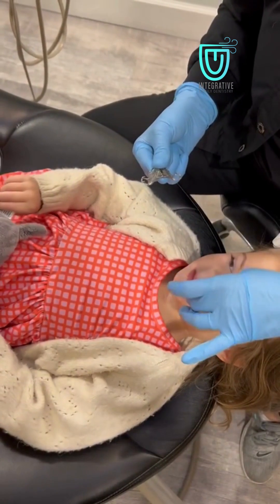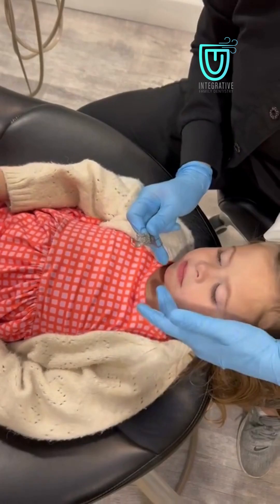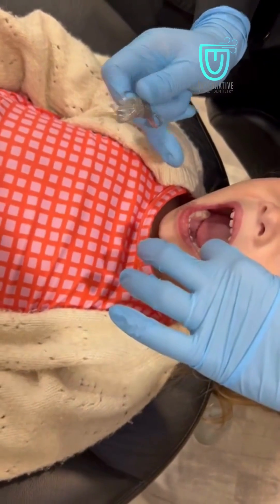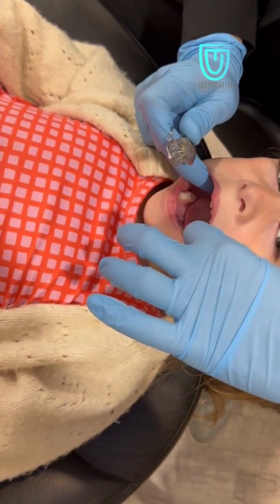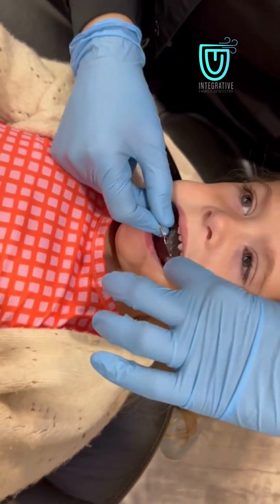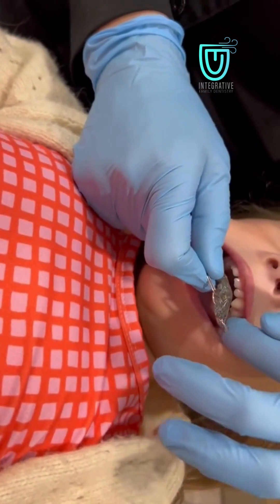What we want to try and avoid is these catching the corners of her lip. The way you go in — just open really big for me — you're going to use your index finger on this side, your middle finger on this side to hold the cheeks back. Before you go in, you go in slanted to the side; these two prongs go between the two teeth.